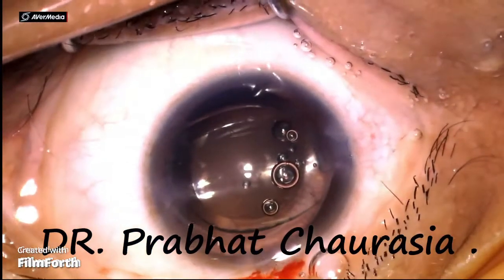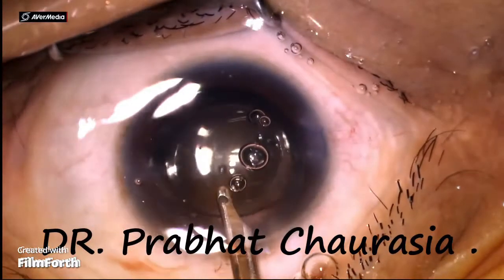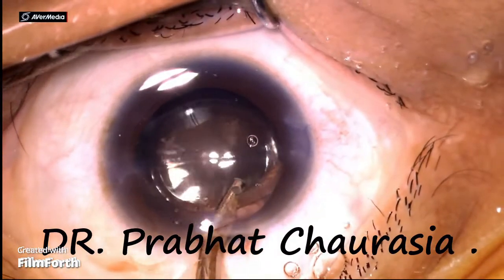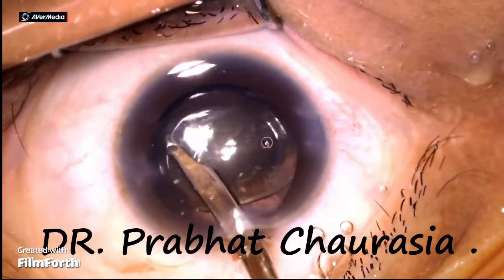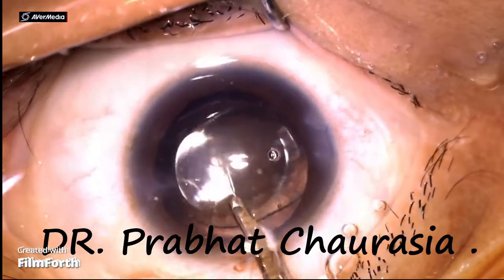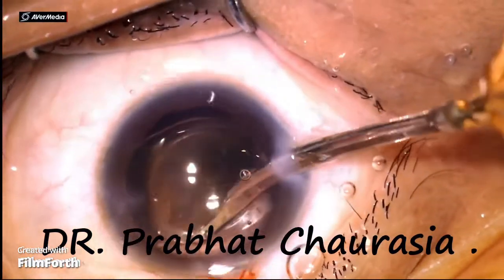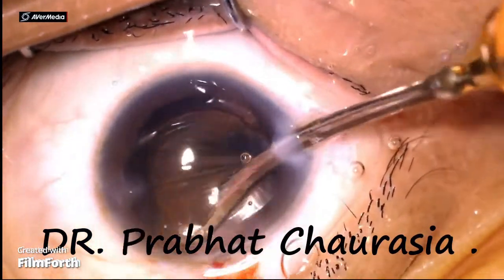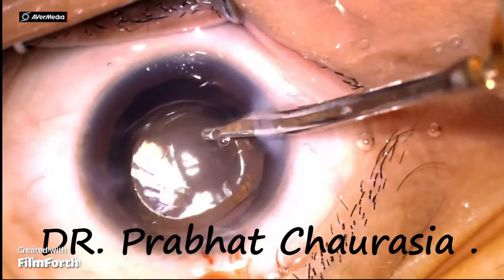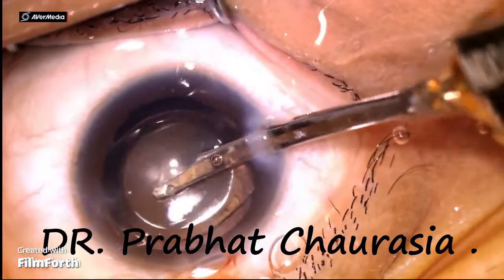Now wash out the HPMC. At this moment I am removing a few cortical fibers which are still present between the rhexis margin and the lens. Clean the HPMC thoroughly — do not leave any HPMC, otherwise it will create raised IOP post-operatively, which will be painful to the patient and painful to the doctor also on the next day.